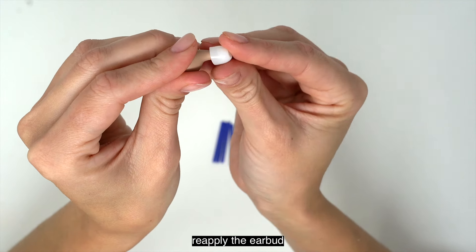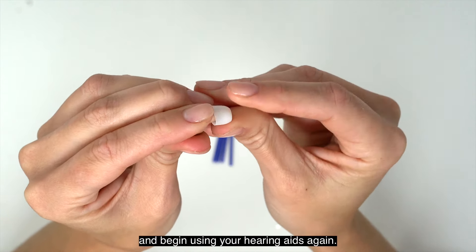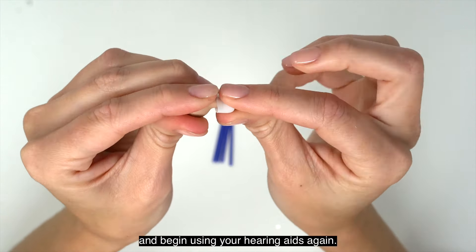This guide will illustrate how to use and maintain your Audien Atom Pro 2 and offer tips for optimal performance.